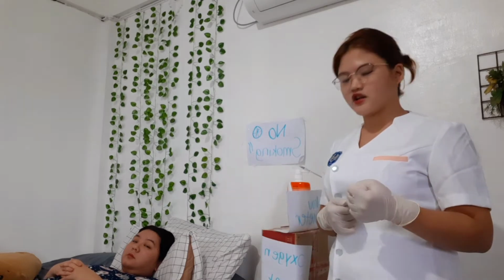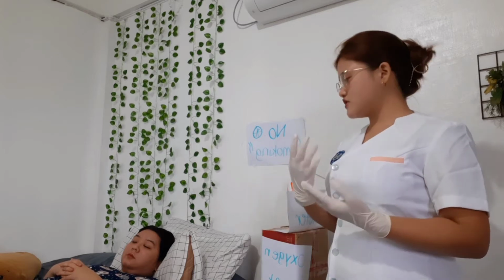So next is I will attach the prescribed oxygen device to the oxygen tubing. You need to attach the oxygen source through the humidifier. So what is the rationale for that? It is in order to access the oxygen source.